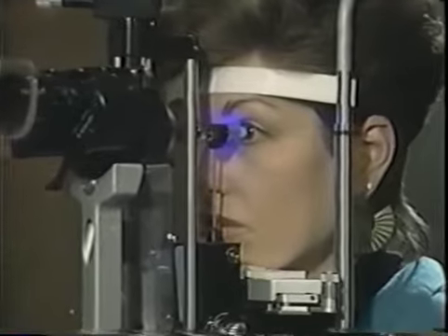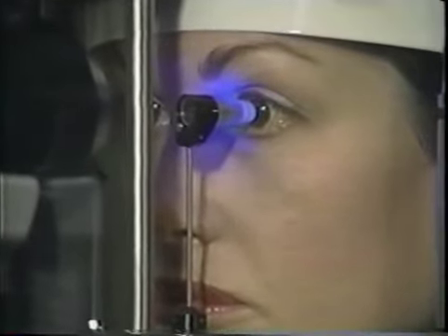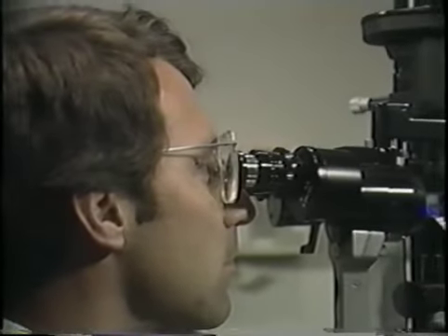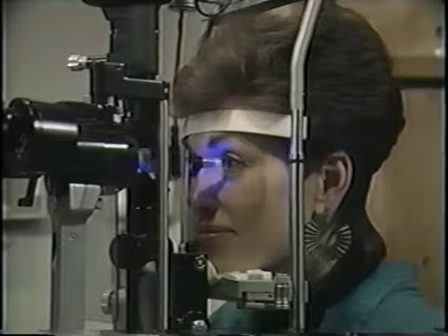In summary, Goldmann applanation tonometry is an important part of a complete eye examination. Developing a routine of testing is essential. Proper positioning of the patient at the slit lamp, maximum brightness of the spot, and good technique will ensure accuracy and reliability for all patients.